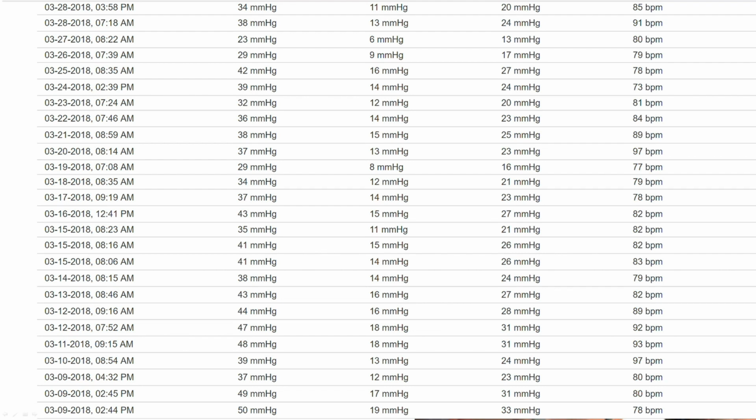Okay, so this is a reading over time of her PA pressures, and her target was about 14, 15, 16. And you can see that she was pretty good about keeping it there, she did bump up here and there. And I just want to point out this 8 over here for one day. And I didn't really say anything because it kind of came and went in one day. But you see it happened again about a week later. And this was a patient that I was very close to. This does happen to be my patient. And she was somebody that I texted almost every single day from the time she was diagnosed to this CardioMEMS implant. And this happened again.